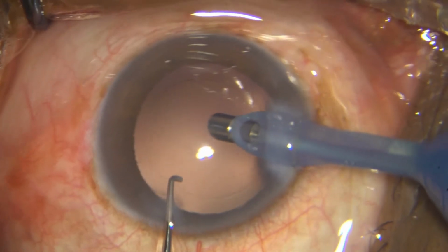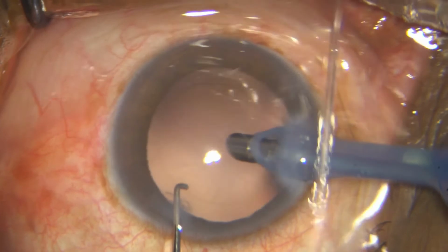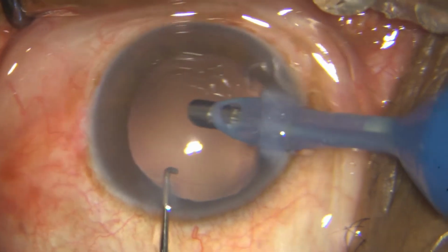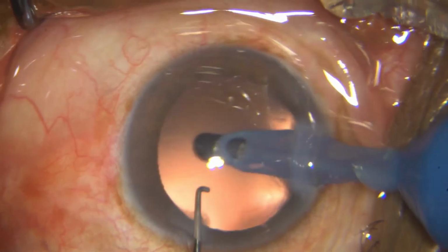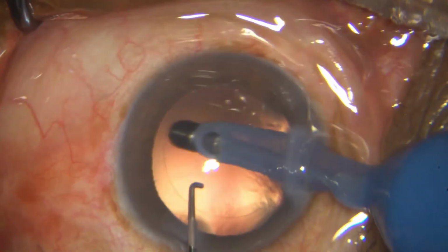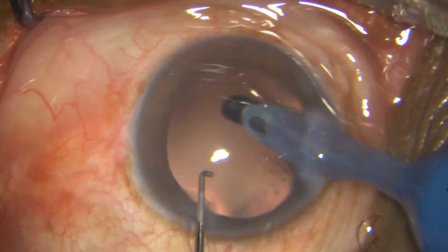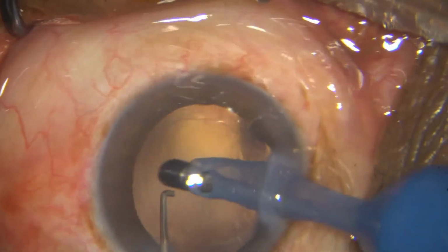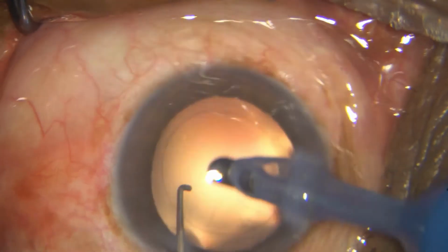And I've gone into the polishing mode now. It's only 5 ml flow rate and 5 millimeters of mercury. I'm slowly polishing the posterior capsule, and I'm using more of its mechanical properties than holding on. Do not hold on to the capsule. So I'm not going to be doing this extensively. That's enough.